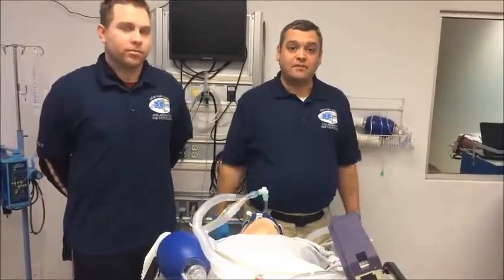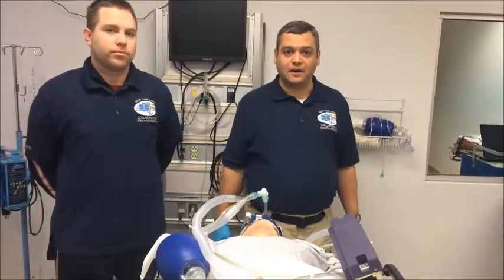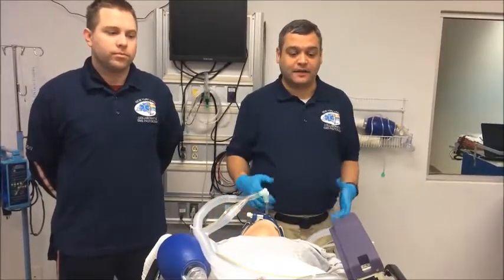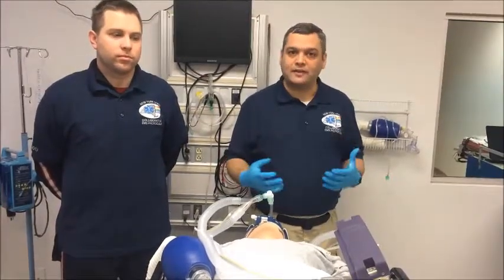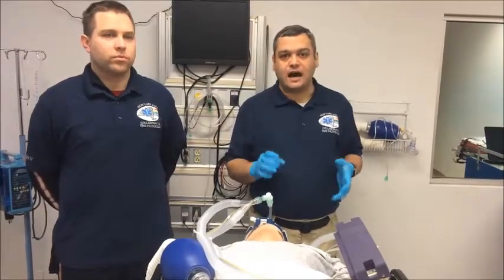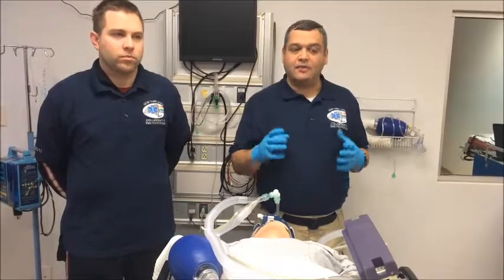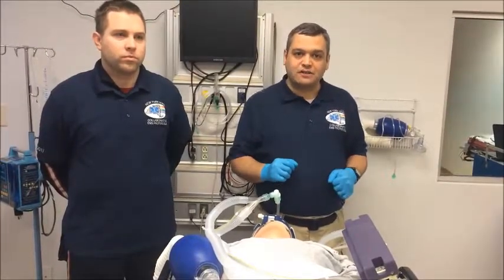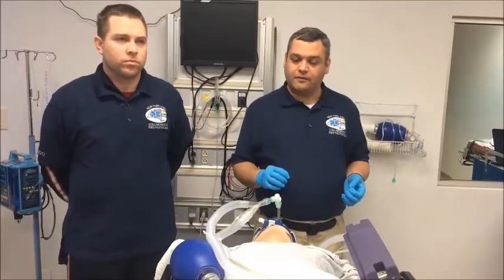So thank you guys very much for your time. I hope that was helpful for you. Just a couple of things in regard to the automatic transport ventilator. When you use it, you have a lot more control over the rate as well as the other parameters. Remember that if you need to adjust the oxygenation, you can adjust the FiO2 or the PEEP. And if you have some issues with the ventilation of the patient, you can adjust the rate or the tidal volume.